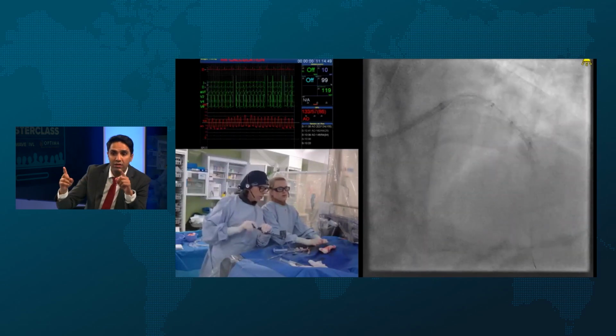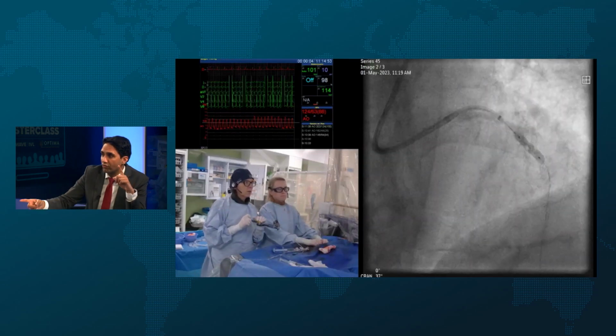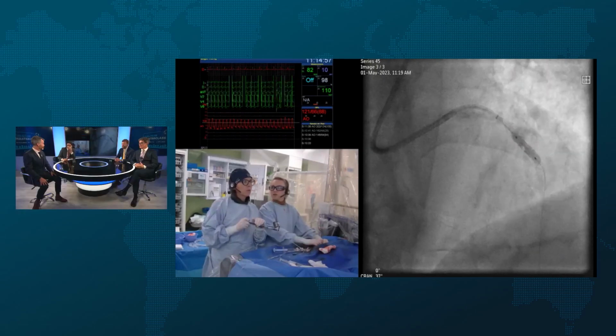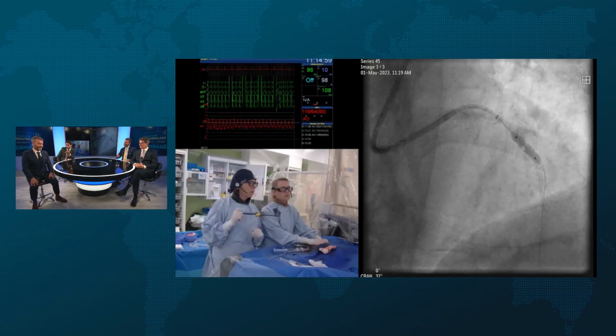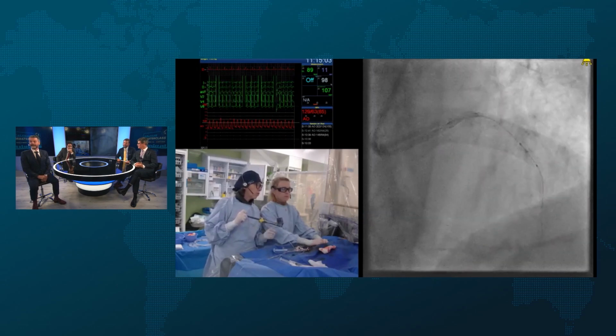And so you will tend to elongate your length when you do a long IVUS run compared to if you do a short. Okay. Yeah. Because this doesn't look like 48 to me. Right, exactly. I think it's probably going to be 35-ish. That's a great point. It's going to be 42, I think.